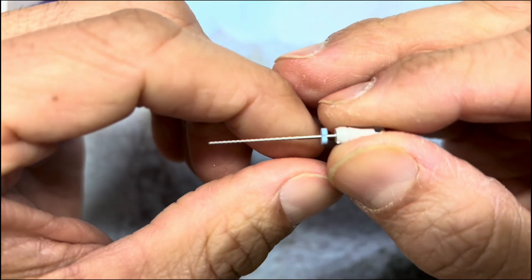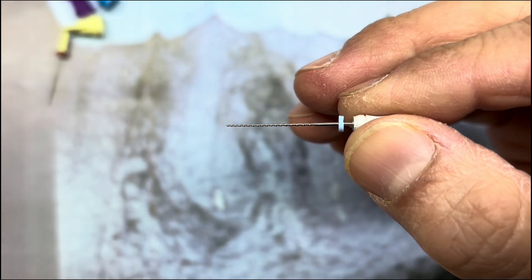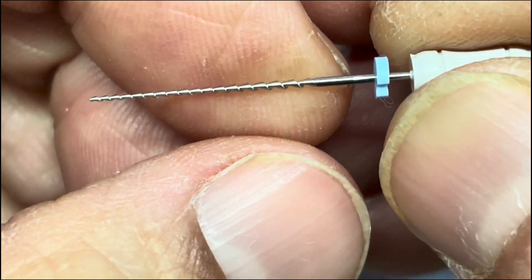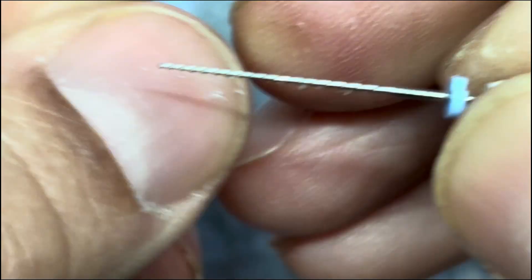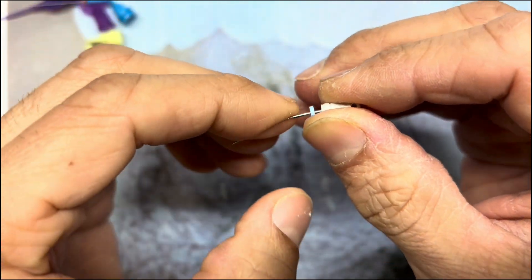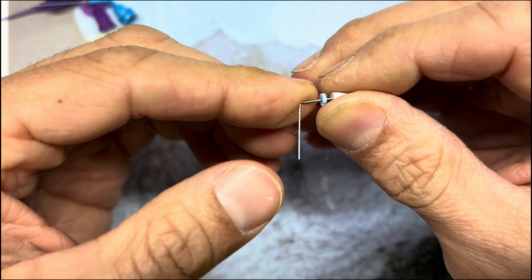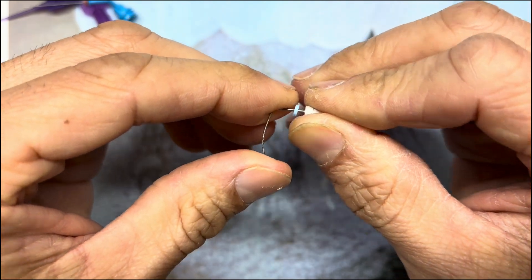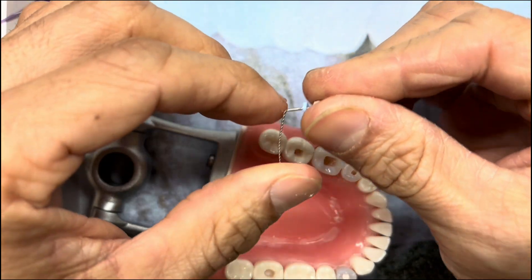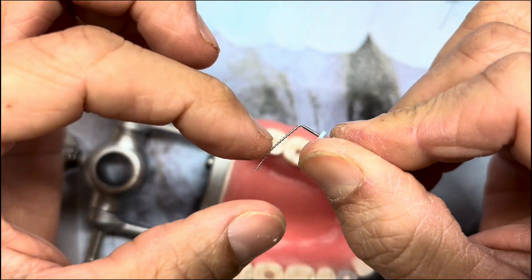Another last-ditch attempt is using a Hedstrom file. Let's zoom in on this. Hedstrom files are great because they are used for filing — you can see on my nail, used for filing. What's beneficial is that you can bend them like this and use them kind of like a feeler. I've bent this one at 17 millimeters.